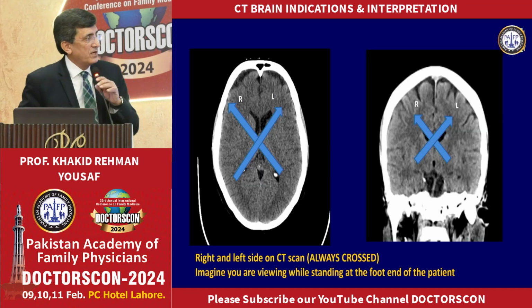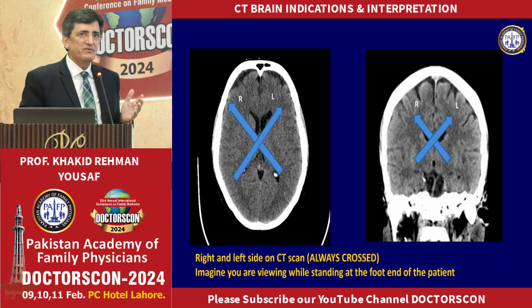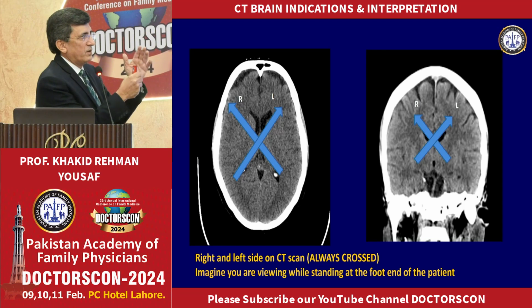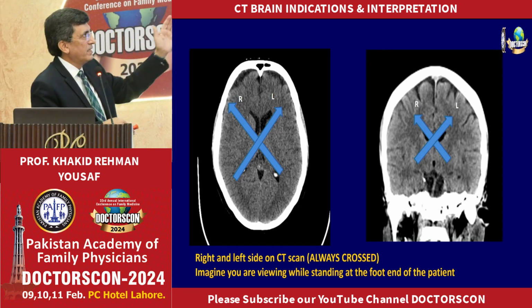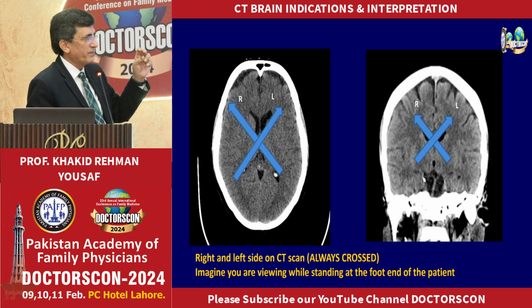Another aspect: when you see a film in your hand, how do you tell which one is the right side and which is the left side? Remember, when you hold a film in your hand or view a monitor, the image side on your left is the right side of the patient. You are viewing as if you are standing at the foot end of the patient.